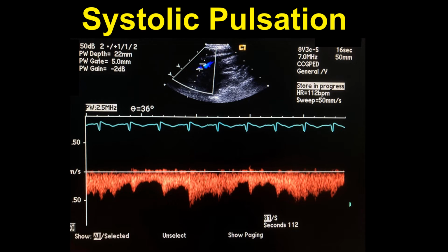So this came as a big surprise. We can see that there are systolic pulsations. It's very difficult to explain. I have no idea how this is happening, but I can see that respiratory augmentation, and it seems that as the patient breathes, he's augmenting his blood flow and the systemic venous return. If anybody has any ideas about these systolic pulsations, please let me know.